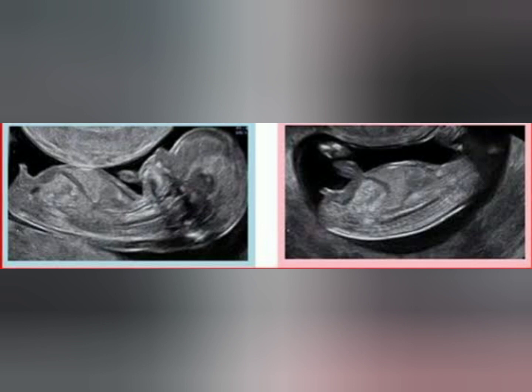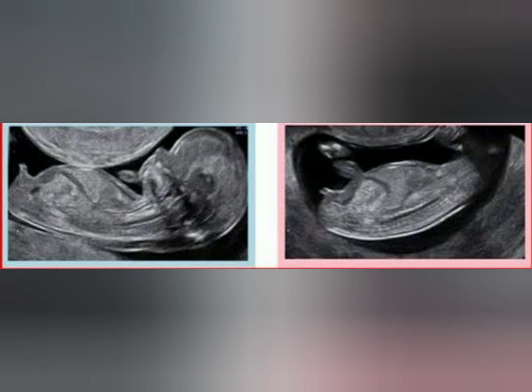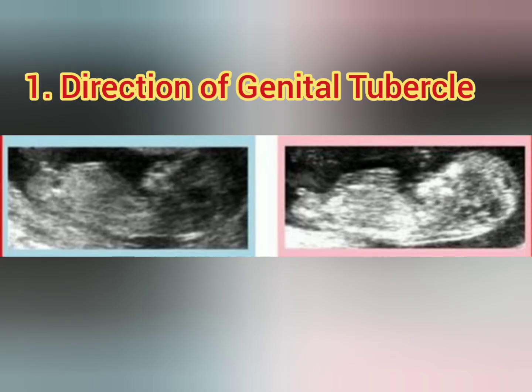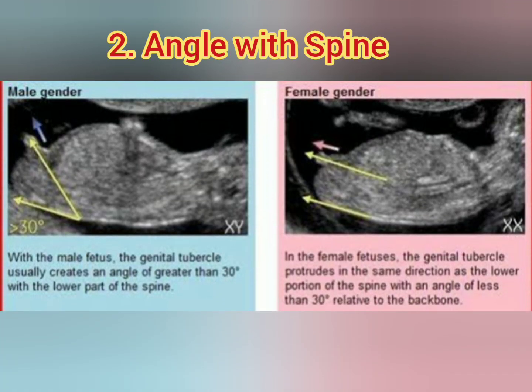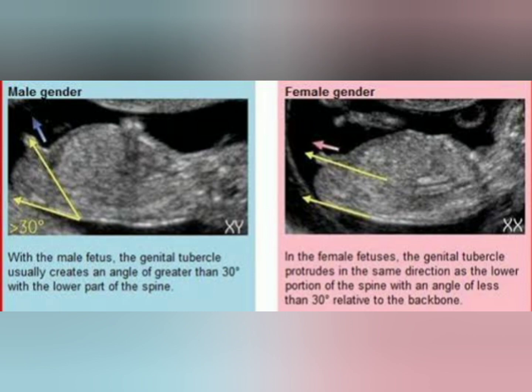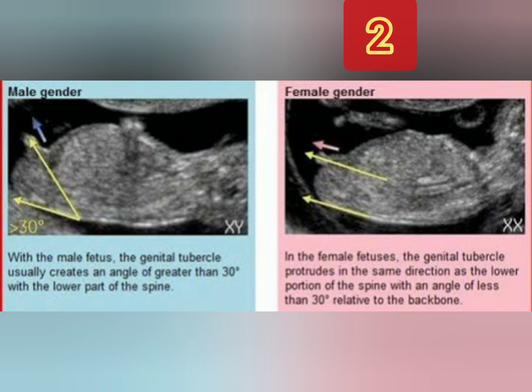First, you will scan the baby in the sagittal position and find the fetal spine and genital tubercle, as marked in this picture. Then try to focus on the direction of the genital tubercle — if it is towards the spine, it is a female child; if it is opposite to the spine, it is a male child. The second point is to measure the angle between the spine and the genital tubercle. If it is more than 30 degrees, the baby is male; if it is parallel to the spine or less than 30 degrees, it is a female child.